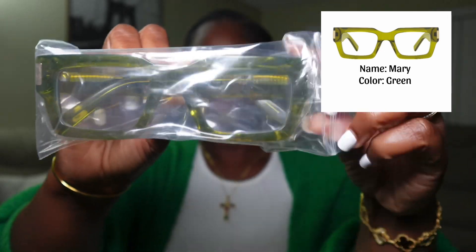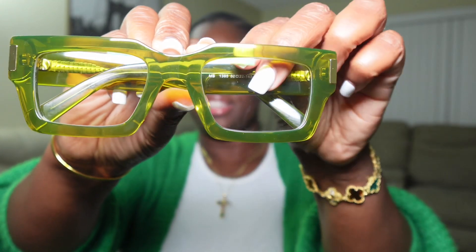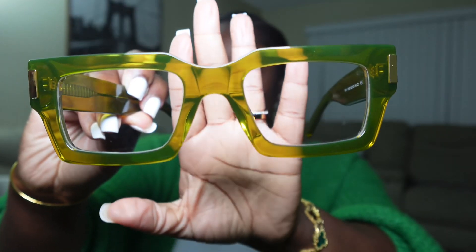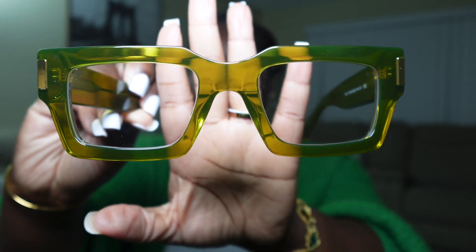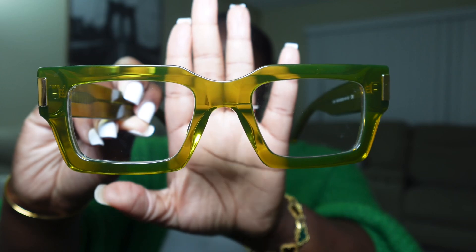The second one — the case is the same, branded Fytoo. Let's open it and see what it's giving. This one also has a cleaning cloth. This is the glasses — the color is amazing, love the green. The quality is there, I'm not joking. You can just feel it by how firm the handle of the glasses is.